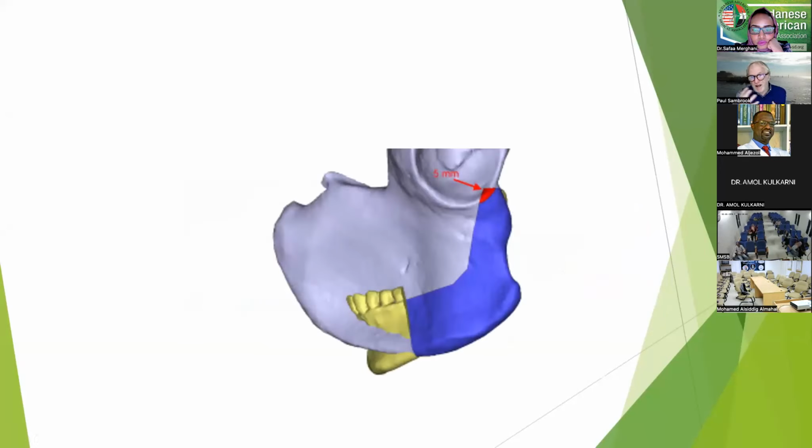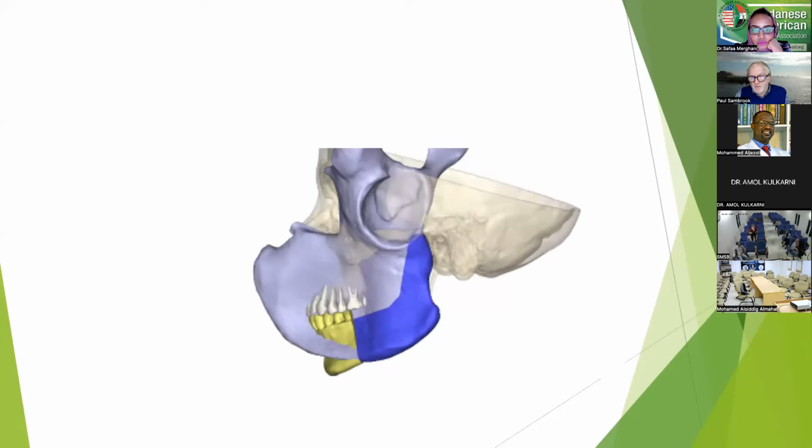Again, just overlying each of these reconstructions on the particular bones to see what would provide the best option. And these overlays are really interesting, a good opportunity to see what the thickness of bone is, not just a two-dimensional reconstruction. In the past, we thought we were doing really good reconstructions just filling a hole with tissue. That is no longer the standard of care that we need to be aiming for.